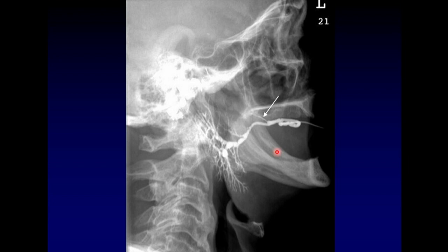I want to point out one extra duct here. This duct is coming off very early, way before the rest of the gland. That is the duct leading to the accessory lobe of the parotid, which we discussed earlier.